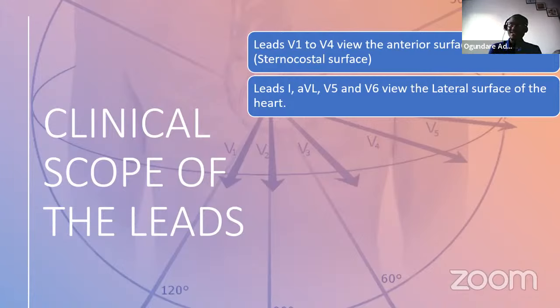So if there is a myocardial infarction showing on the ECG, and those changes affect leads V1 to V4 and also the lateral leads, then you can say, okay, it's anterolateral infarction. It's just bringing 1 and 2 together.